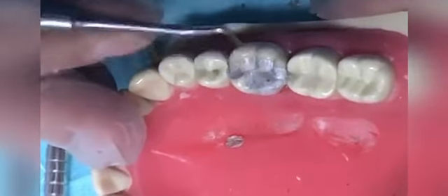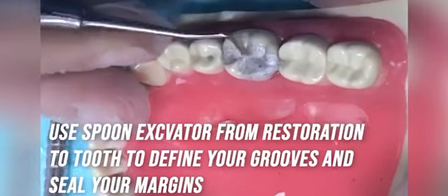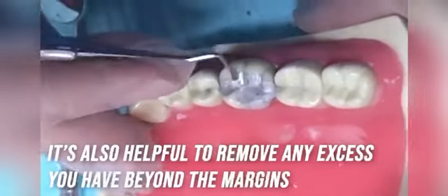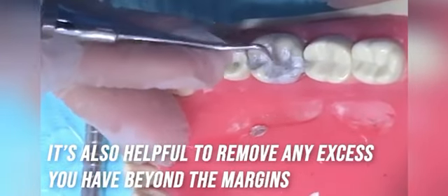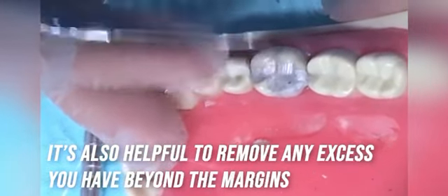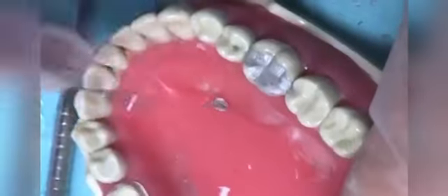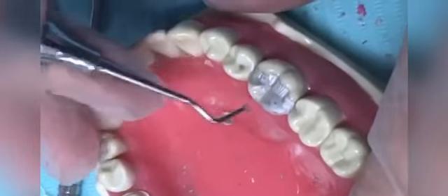One of the criteria is there should not be any extra debris. So if there is any debris on the tooth surface, you can just use the spoon excavator or any instrument to remove the debris. But be cautious that you do not create any ditch while doing that. In the end, you can use the high suction to remove the debris from the back of the throat.